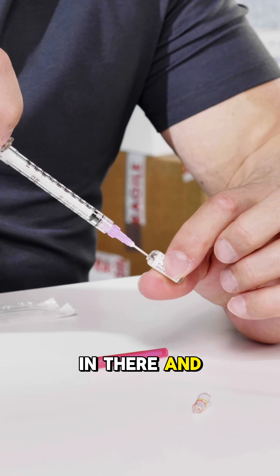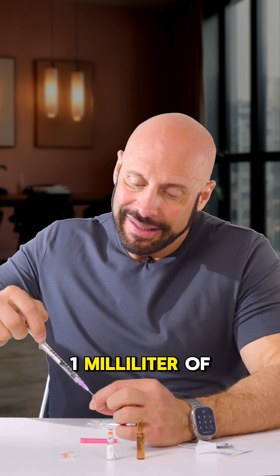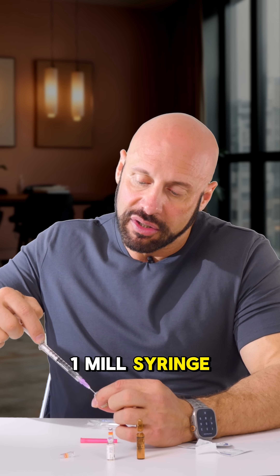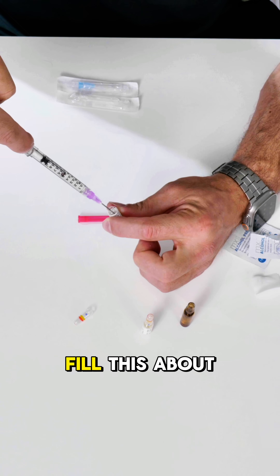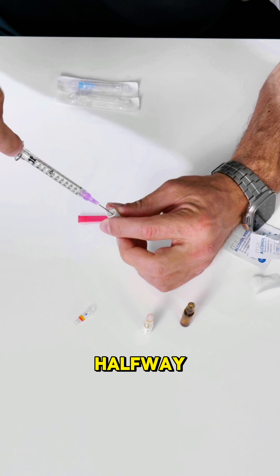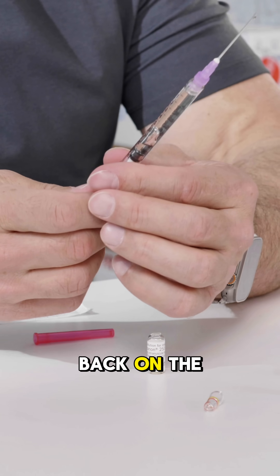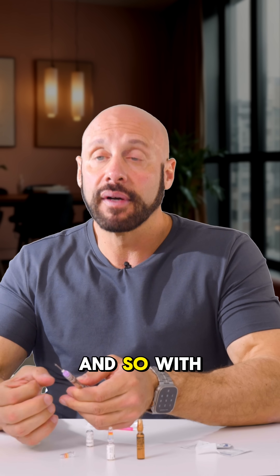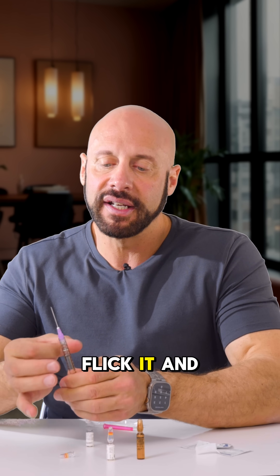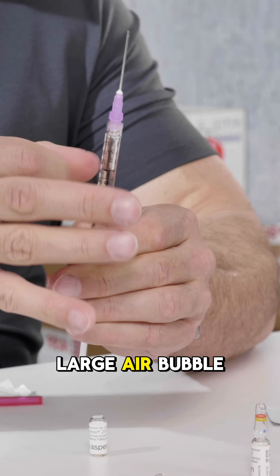You just place it in there. What I find is it's sometimes really hard to fill a milliliter of solution in a 1ml syringe without having issues. My technique is to fill it about halfway, then stop. You'll see a bubble in there — pull back on the plunger to get more air. With all those air bubbles, just keep flicking until you have one large air bubble.